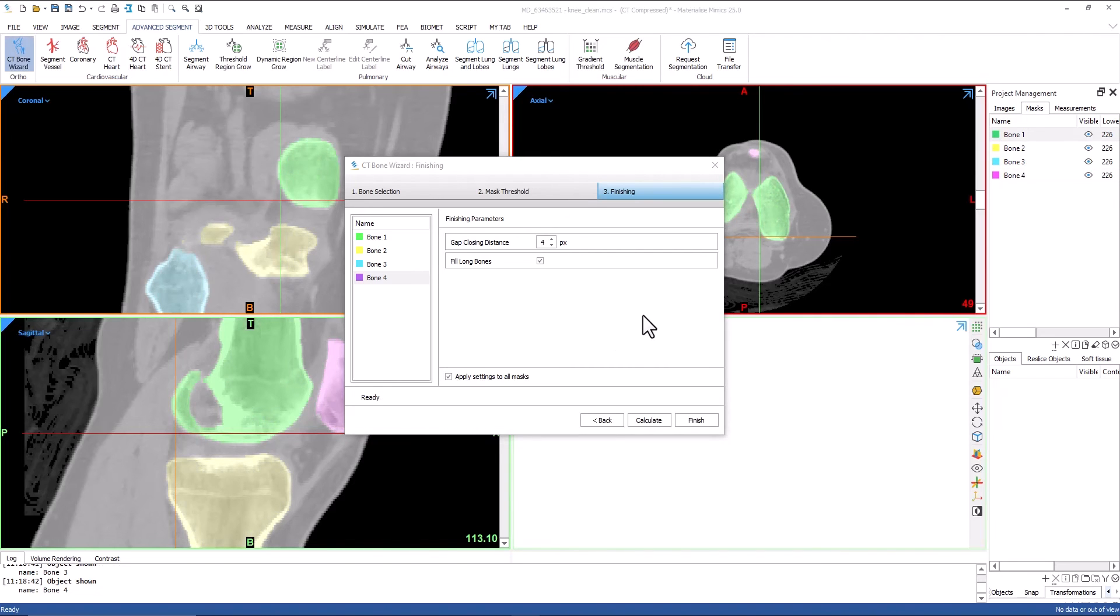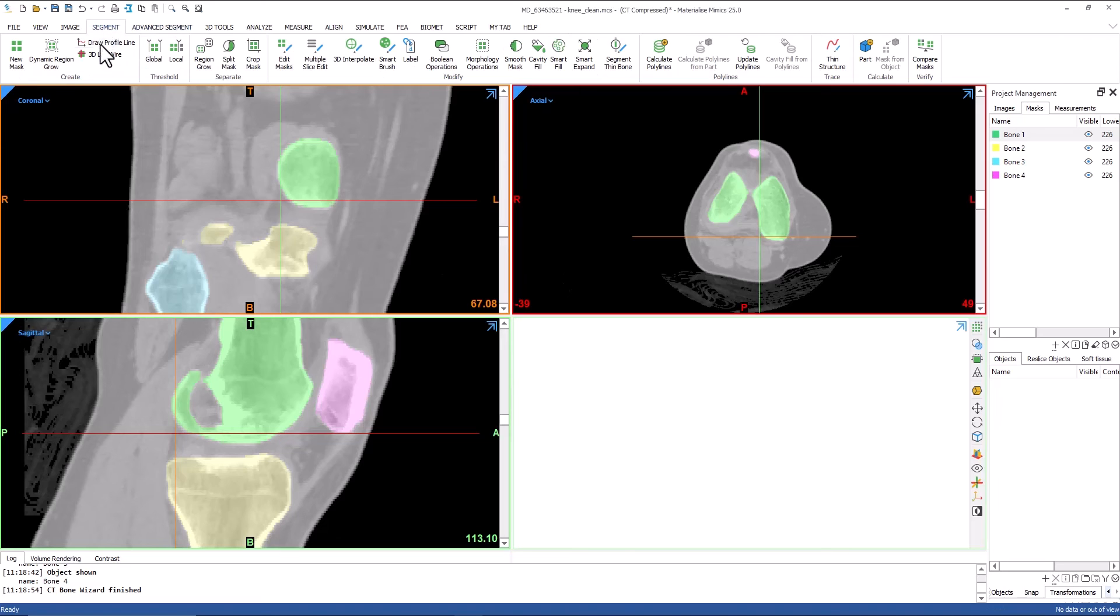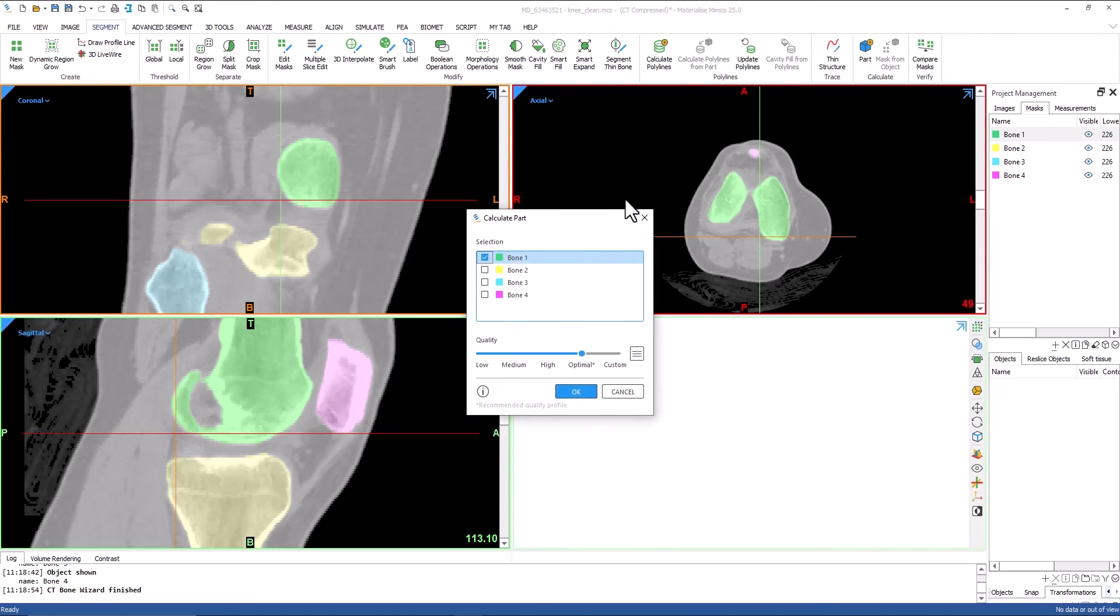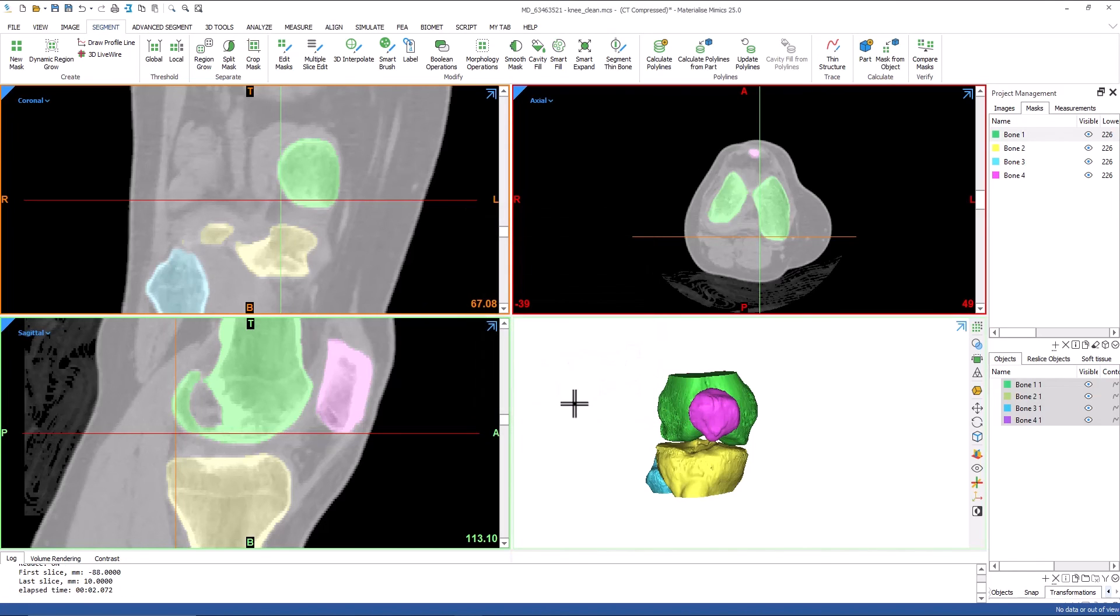Now that I am happy with the results, I will click finish to exit the CT Bone Wizard tool. Next, we will convert the masks to objects. From the segment menu, I will click calculate part and select the bones I would like to use. Once calculated, I can turn on the contours and check the anatomical accuracy of these bones.